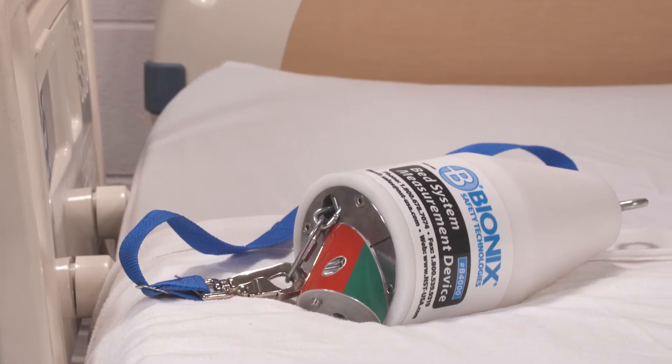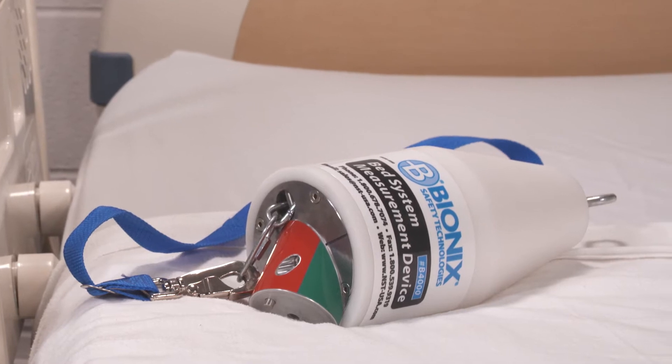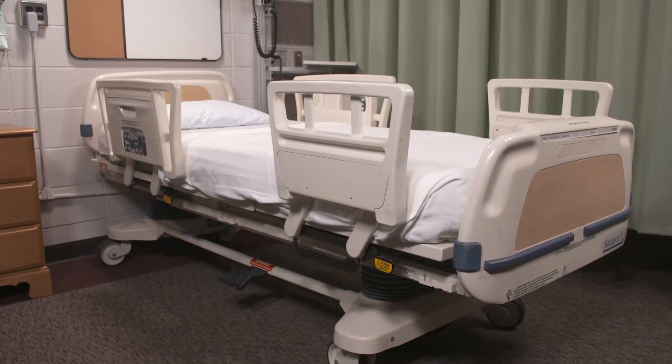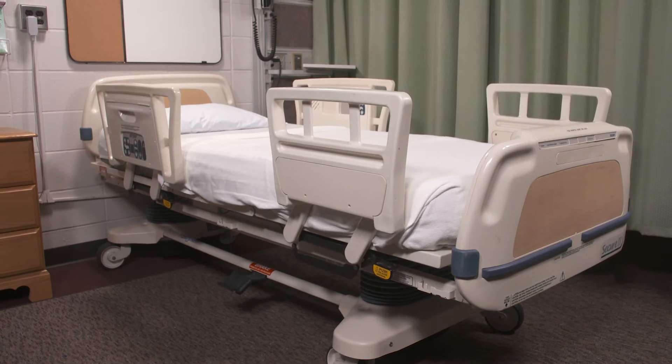Zone 3 is the area between the edge of the mattress and the inside of the side rail. To test Zone 3, you will need the cone of the bed system measurement device and an unoccupied hospital bed in a flat horizontal position.